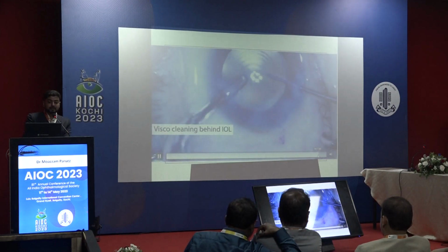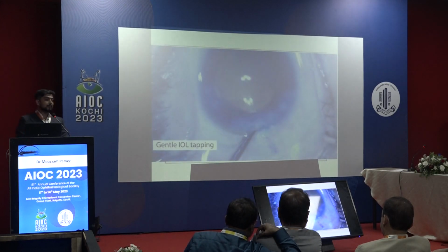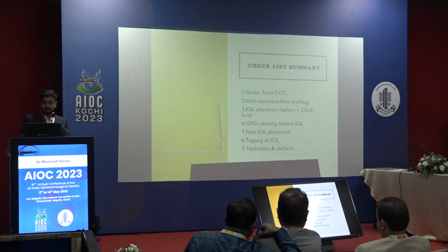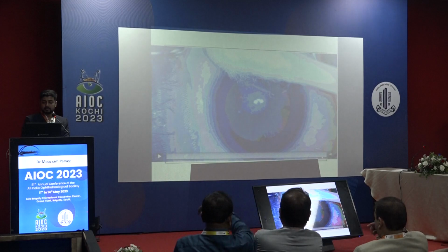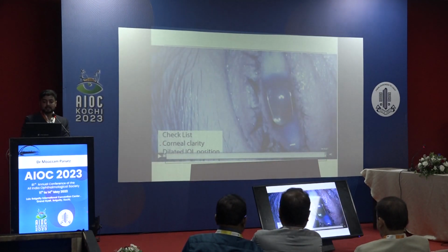We would do viscoat cleaning behind the lens, gentle tapping and hydration would complete my case, where I would see the alignment. As you can see here, the diamond markers are visible, and the post-op dilated IOL position is marked with the marking and the diamond markers.